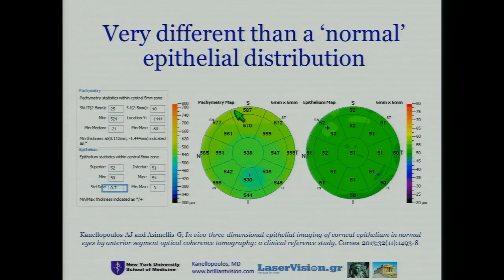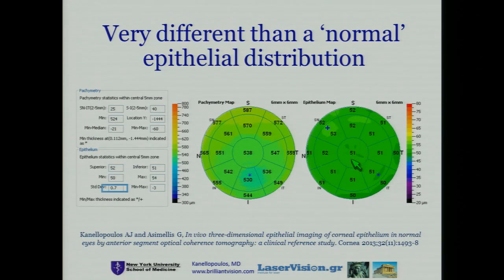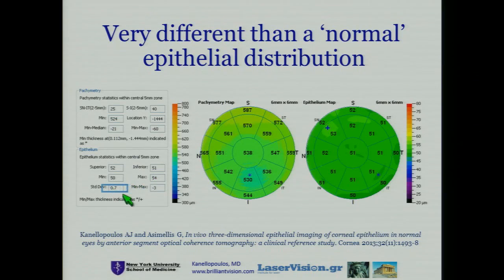Here we can see how a normal epithelial distribution looks — it's all green, as Dr. Asimel has told you before. We can also see the standard deviation, which is 0.7, and this is an interesting thing to note.